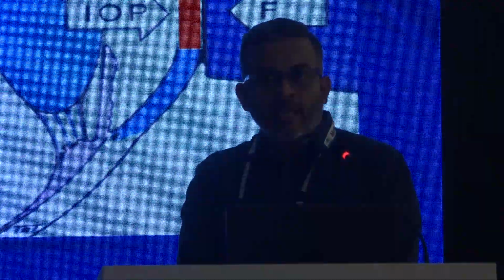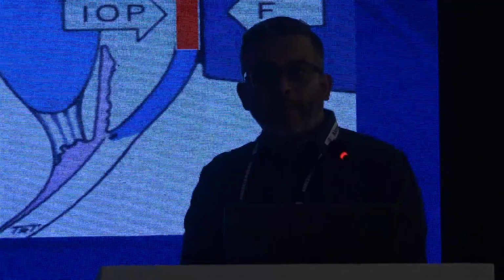Why I put this first is because the most common tonometer, the most accurate gold standard that we use, is the Prism Goldmann tonometer. This is a variable force. The area, the size of the tip, is a constant. So the area is constant. It is the force that you vary when you turn the knob around. So basically, the variable here is the pressure that is being applied when you are turning the handle. You are going to be using external force to flatten a given area.